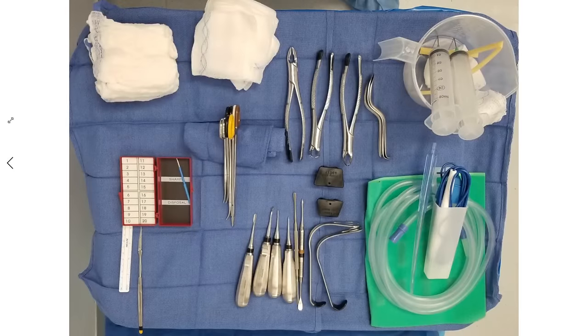Okay, let's take a look at the instruments that we're going to use during this surgery. Here you can see the Mayo stand is what this thing is called. That's a sterile towel underneath it. Here's a little sterile towel rolled up to help support these instruments. And this stand will be placed closest to me so that I've got easy access to the instruments that we're most likely to use during the surgery. And then I'll show you here in a second, we're going to have what's called a back table, which is a bigger table full of instruments that we're less likely to need, and so we don't have them quite as readily available. So let's just start in the upper left.